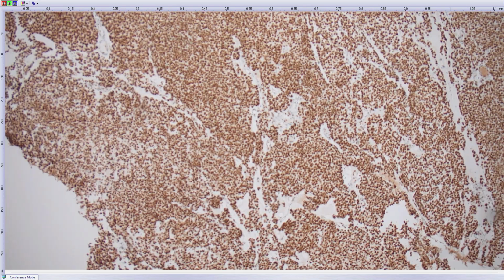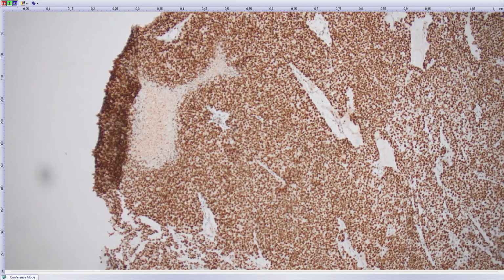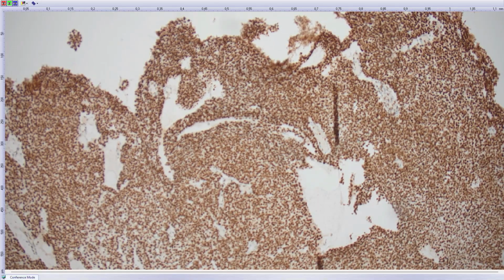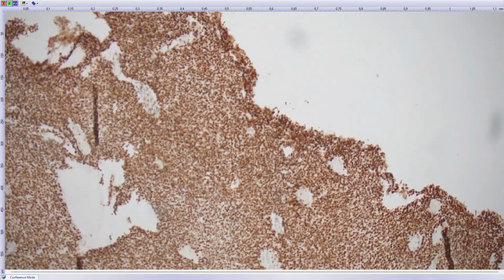There's also one more recent marker for GYN origin, and that is SOX17, which is, according to probably 2 or 3 studies right now, even more specific and more useful than PAX8 for GYN origin. So SOX17, also you see diffuse strong expression.